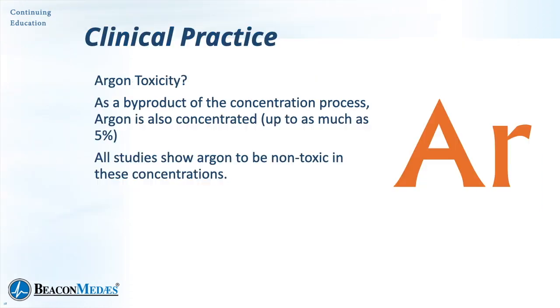Now, this question of argon, is that a problem? Well, the fact of the matter is that no, it's not. In these kinds of concentrations, it's been conclusively demonstrated this is not an issue. At 5% concentration, argon is entirely non-toxic. So, for the most part, this is not a problem at all.